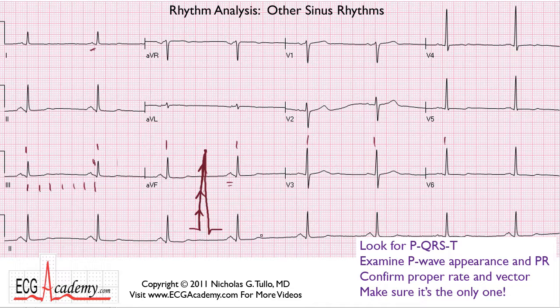It's almost like, if you look at sine waves, electronic waves of electrical energy, sine waves are measured in frequency. How often do these occur? And that's related to how far apart the waves are. T waves tend to be very low in frequency. In other words, they're very gradual changing in the voltage.